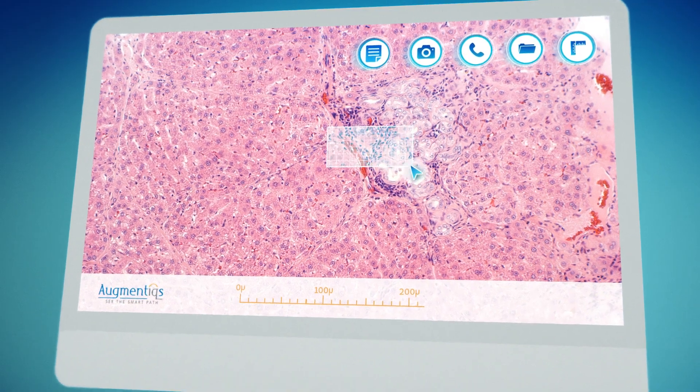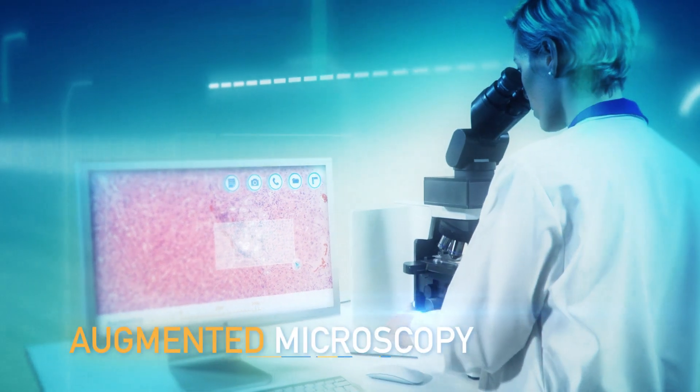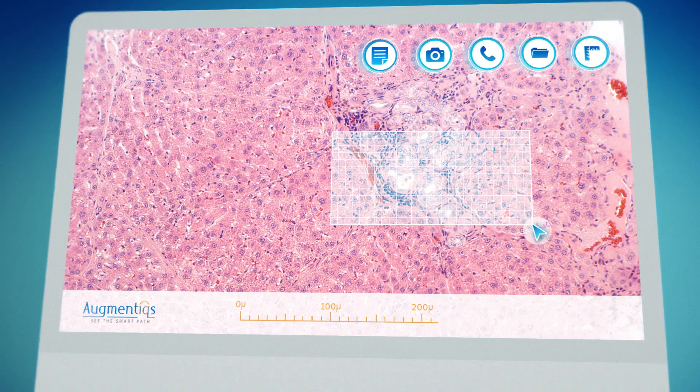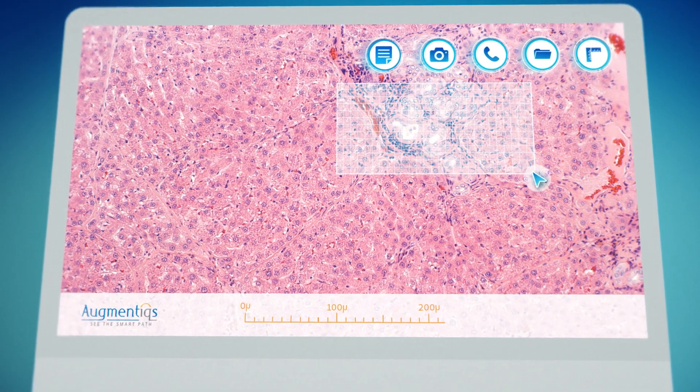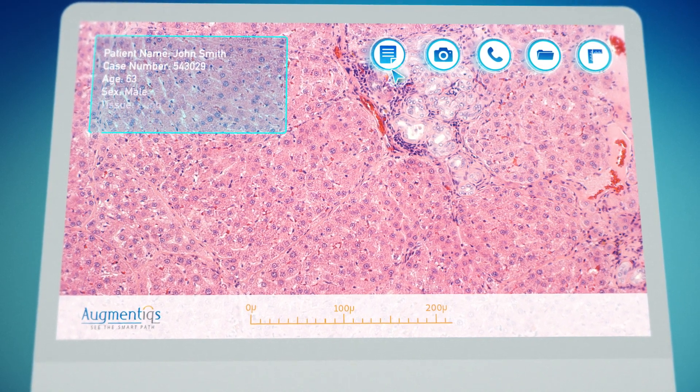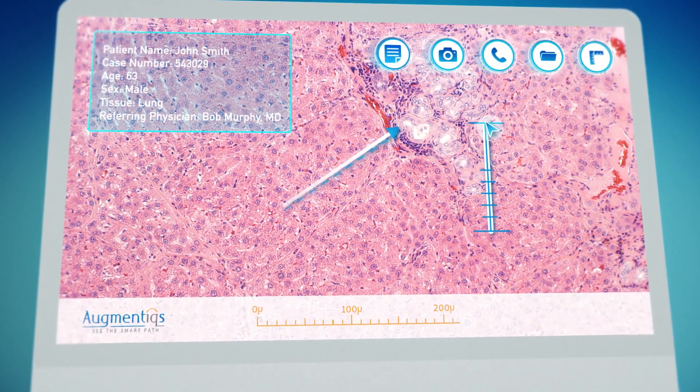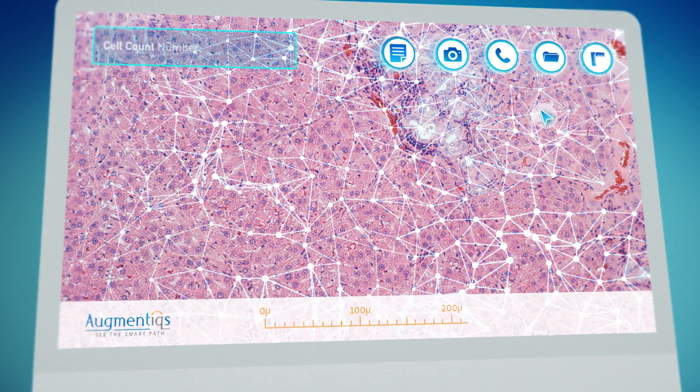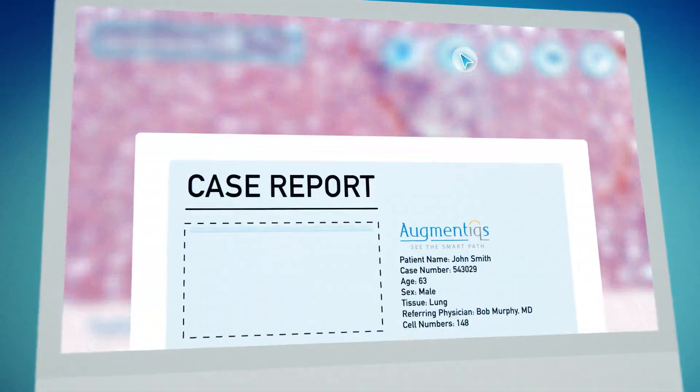A digital overlay projected within the eyepiece allows pathologists to work with the tissue sample while simultaneously viewing case data, perform morphometrics, carry out advanced cell analysis, and even add images to case reports.